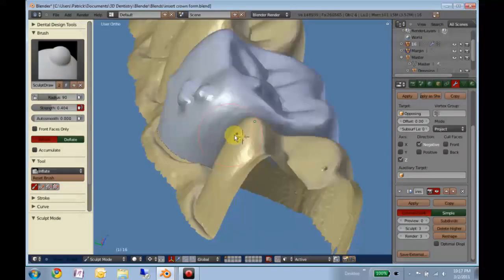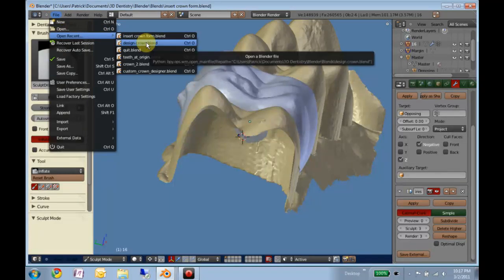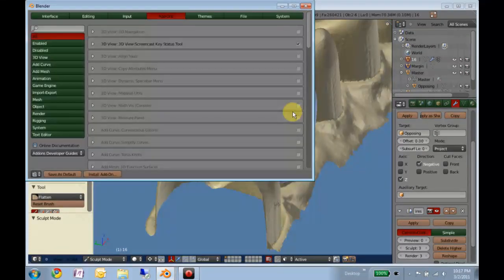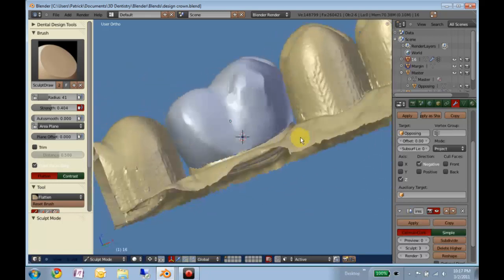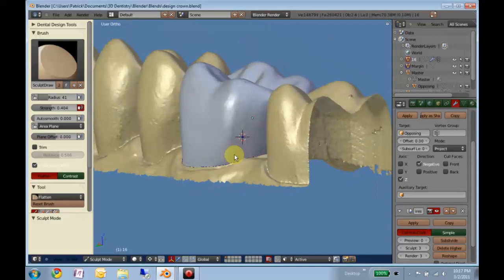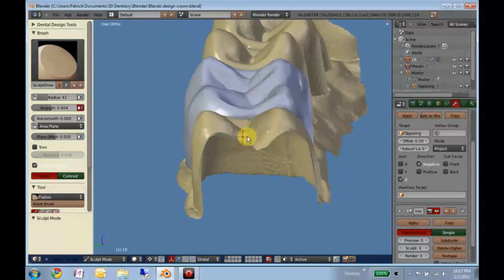I won't take you through this whole process, but I will jump to one that I already did. This will take a few seconds to load. And there's one. I even tried to add a little cusp of Carabelli there. And then from here, it's just one more step to sew the crown to the margin and form the inside. And that's it. A crown from start to finish.